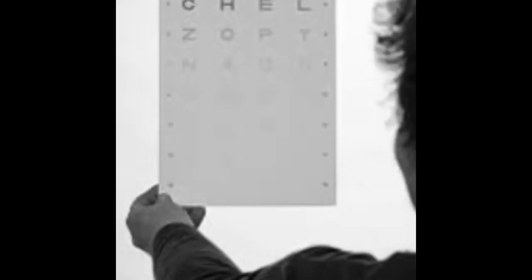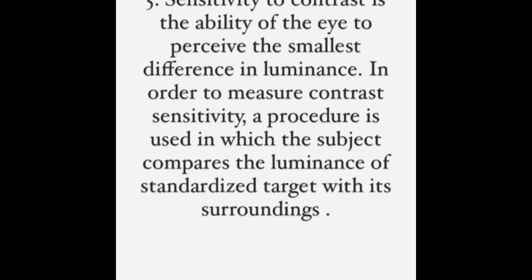Contrast sensitivity test. Sensitivity to contrast is the ability of the eye to perceive the smallest difference in luminance. In order to measure contrast sensitivity, a procedure is used in which the subject compares the luminance of a standardized target with its surroundings.